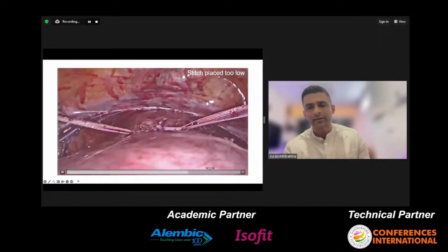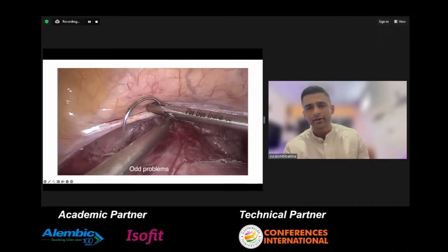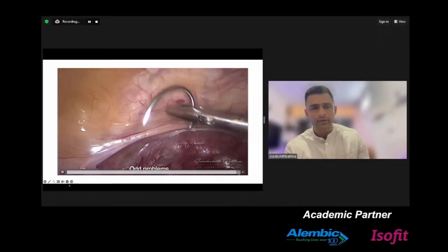Sometimes also you will have these kinds of odd complications, right? When you're trying to remove the needle, it might just pop out.